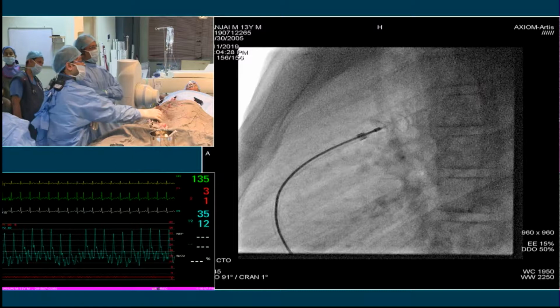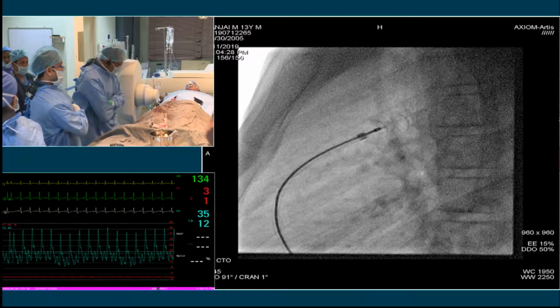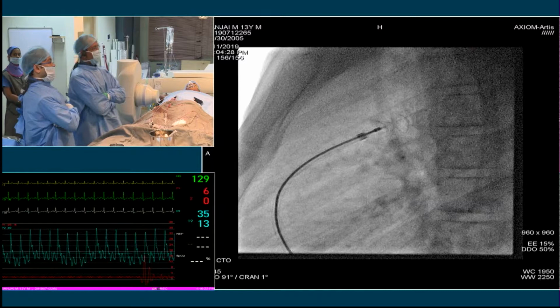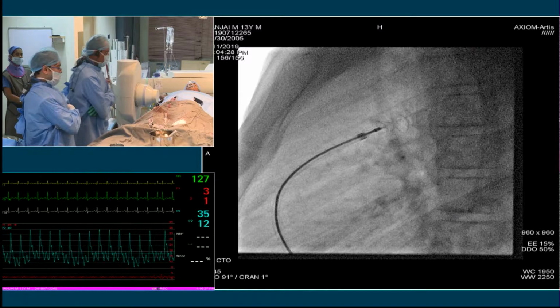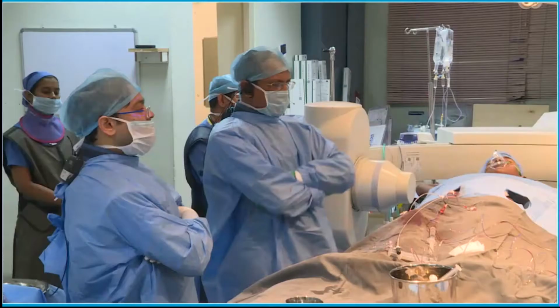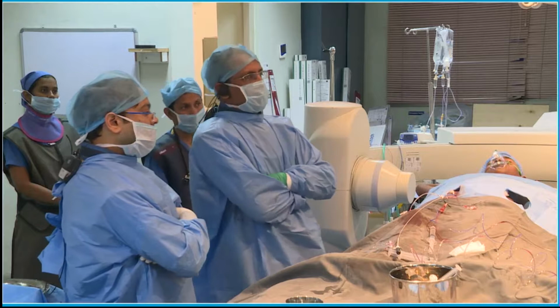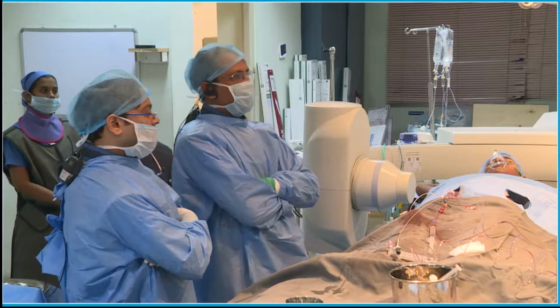So how many of you wait for 10 minutes for the occlusion, then go for the angiogram? Is that your standard practice? Do you wait for 10 minutes? Yeah, I always wait for 10 minutes. Is there any scientific evidence for that waiting period of 10 minutes? Yeah, initially I immediately did the angiogram, then after waiting for 5 to 10 minutes, complete occlusion was observed. Maybe it's cosmetic, but at least you show the patient that it is completely occluded. Otherwise, they point out there is some residual shunt.